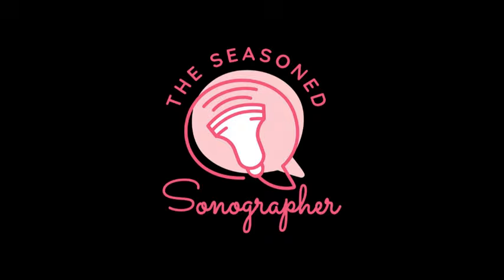And what does an elevated pulsatility index or resistive index represent clinically? When we look at the pulsatility index, what it is calculating is the variation in blood flow velocity between the systolic peak and the diastolic low, relative to the mean velocity.